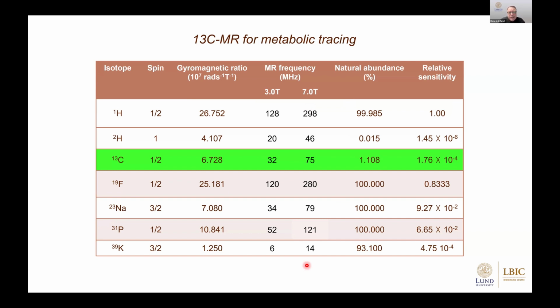but it's a challenge to get carbon-13 of glucose, for example. So what you could do is take glucose and change all the carbon-12s to carbon-13, and suddenly you increase your SNR, your sensitivity for this carbon-13, by a factor of almost 100. And suddenly these compounds can act as a tracer molecule, a contrast agent, if you would call it.